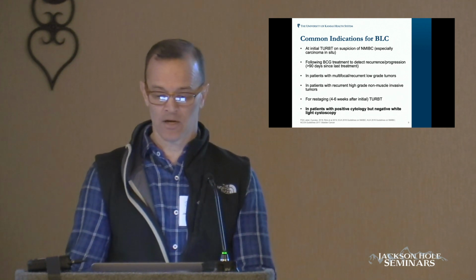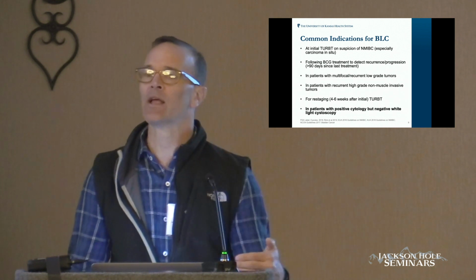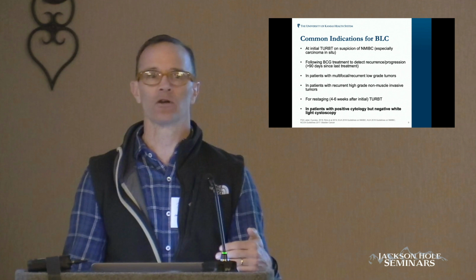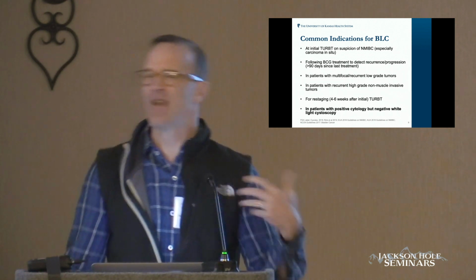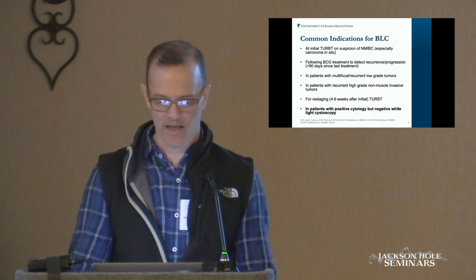Following BCG treatment to detect recurrence or progression. So you have that really high-risk patient that you're really concerned about. You see something, you're not really sure if that's something or not. You take them back, you use blue light to help you resect that disease.